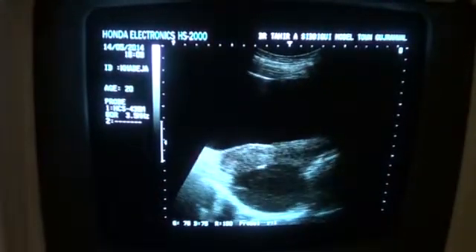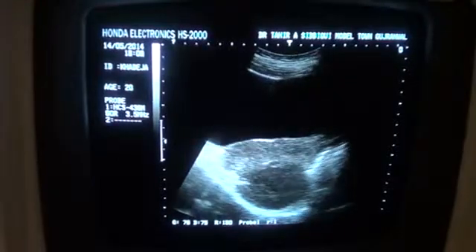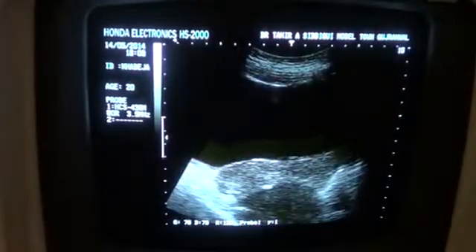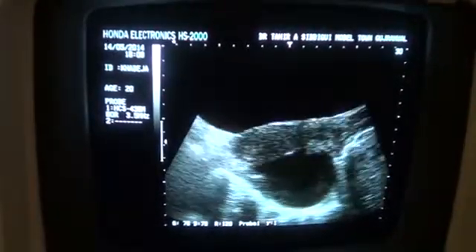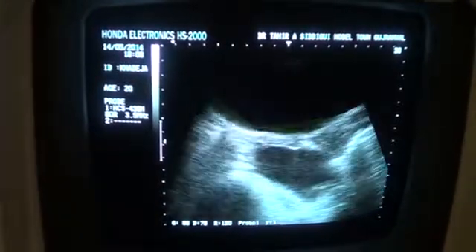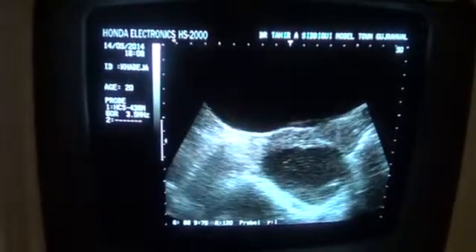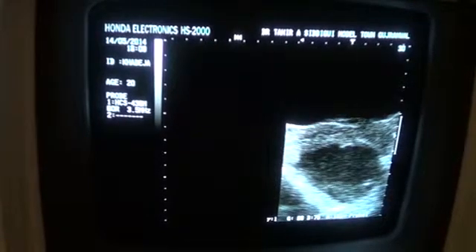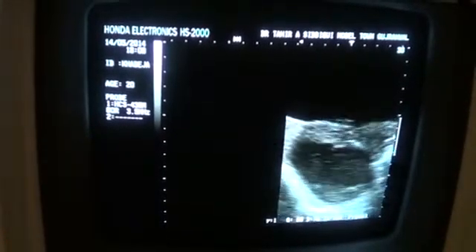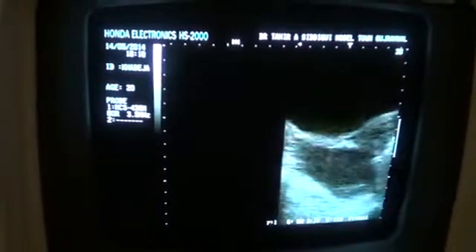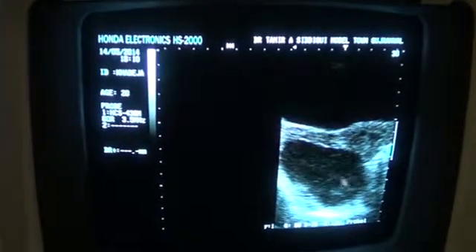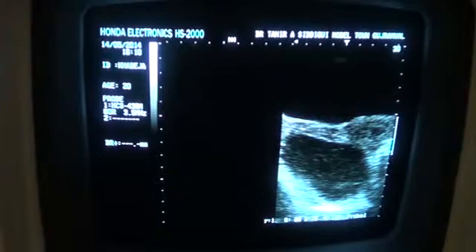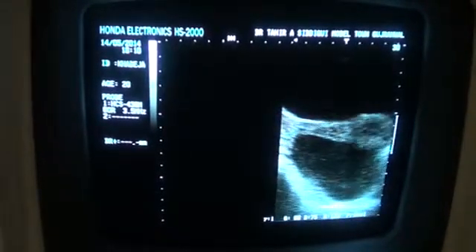And now if you see, just concentrate on the cystic area — just to magnify the view so that we can see clearly that this cystic area is not free of internal echoes, rather it is full of internal echoes. You can see here, in this view it is very clear and proteinaceous echoes are seen in it. These are all echoes floating within this cystic area, which is the ovarian cyst.